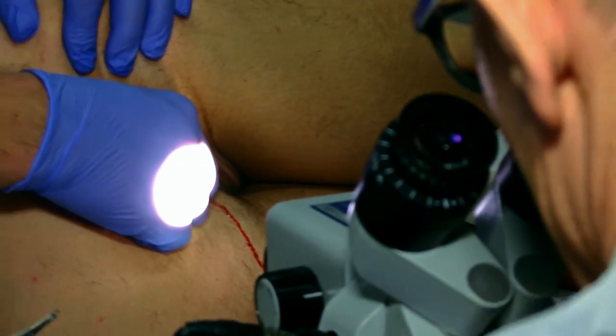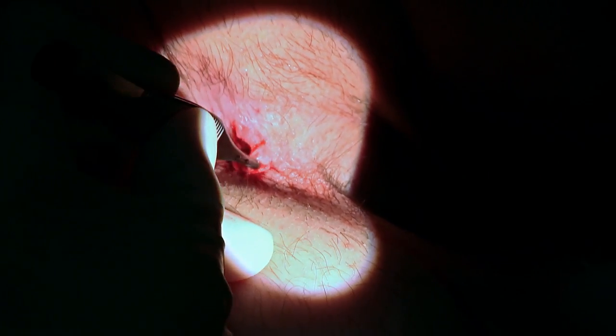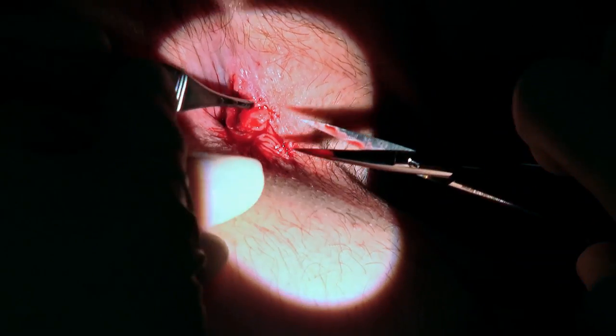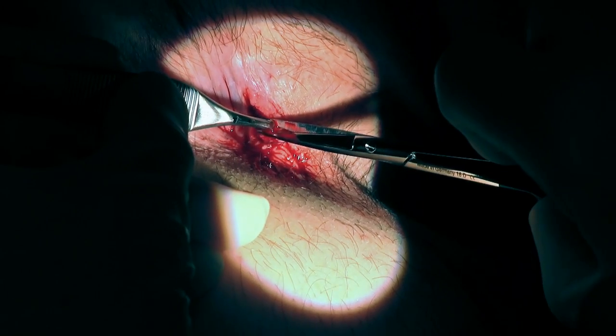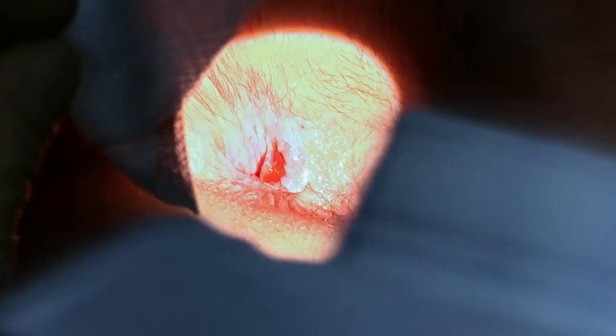Let's have a look again — I may take just one more section, we'll just check. I think I'll take one more section; that way we'll have nice neat edges and it'll be able to heal. A little bit more — okay, well done. That's the biopsy done.